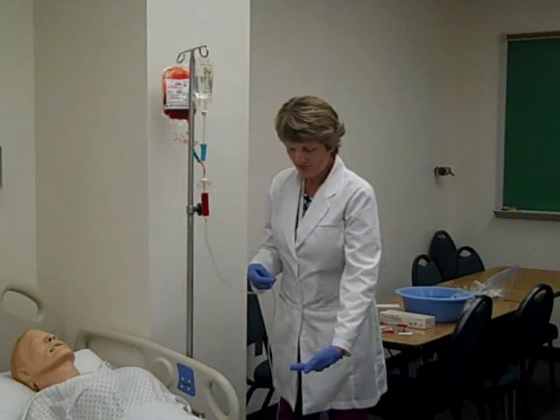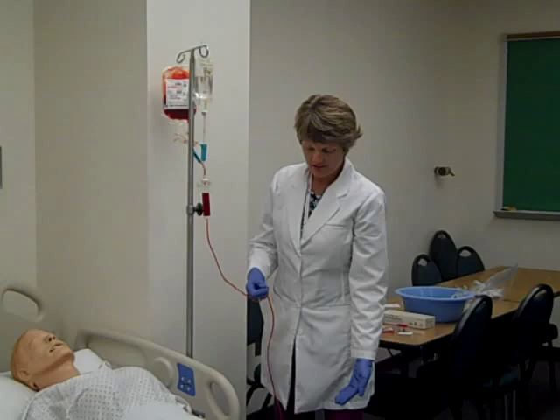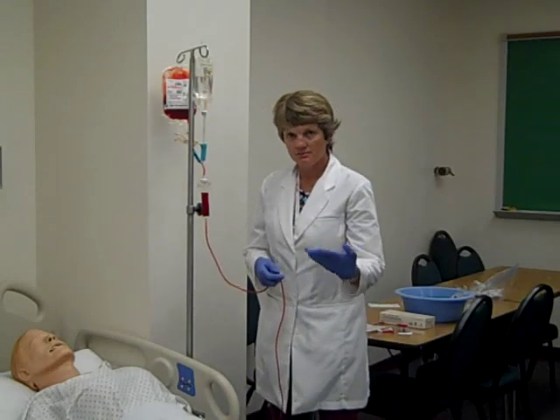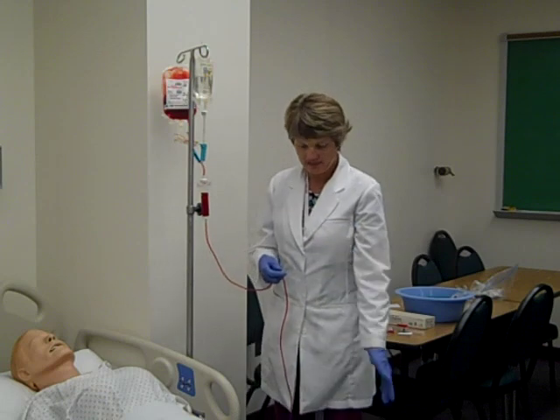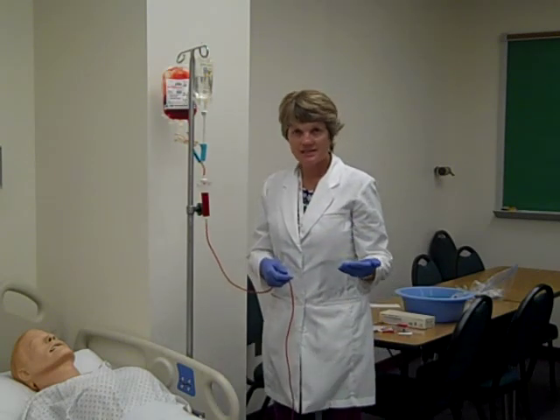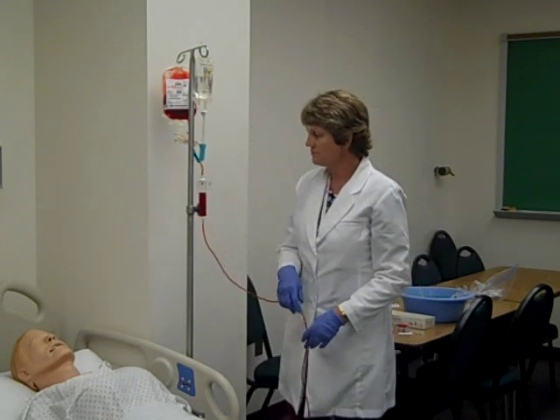Just to push that 15 cc's of normal saline in. And the minute the blood gets down to the saline lock on the patient is when I want to start my time in my first 15 minutes. Because as we said in lecture, the first 15 minutes is the time when someone, if they're going to have a reaction, most likely has that reaction.